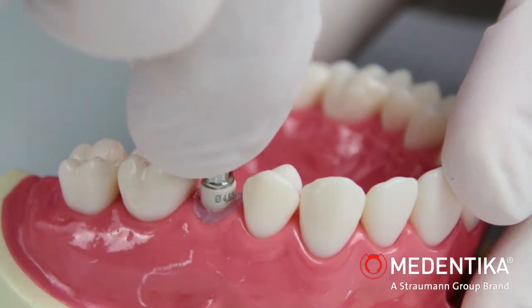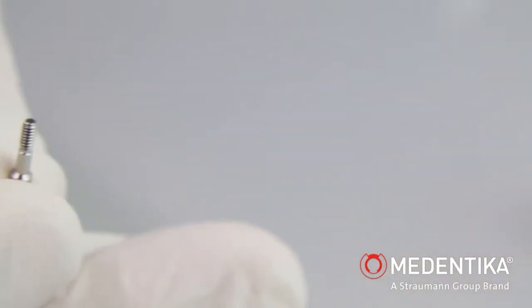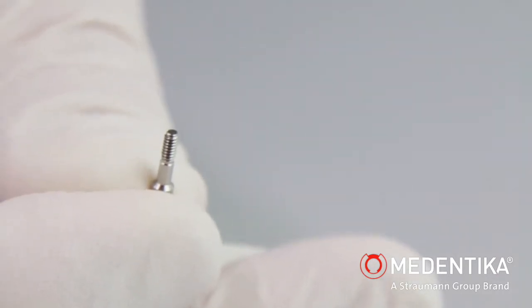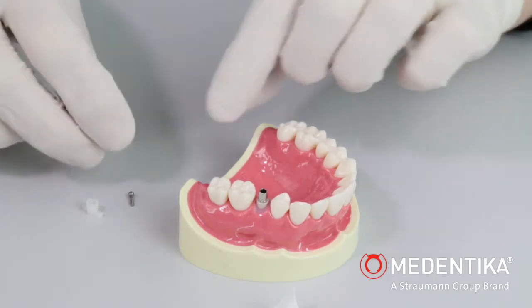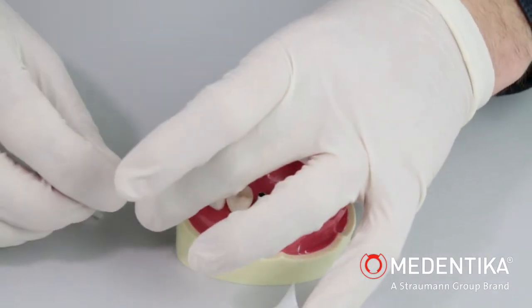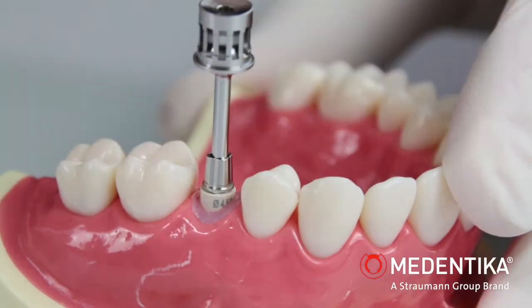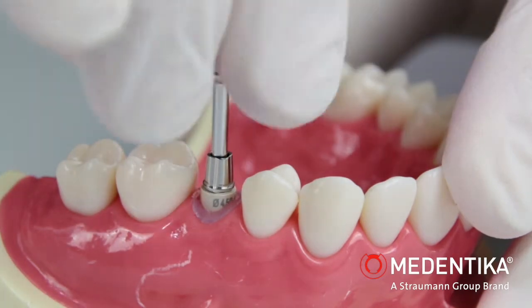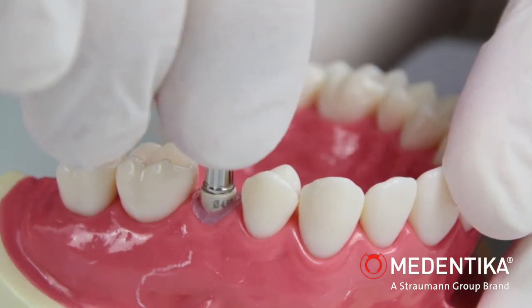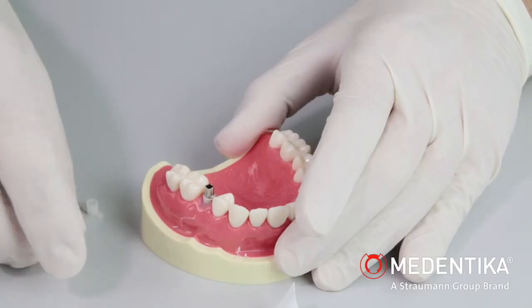The implant pickup and emergence profile are positioned on the implant. The retention screw is inserted in the implant pickup using the corresponding placement instrument. The positioning cap is placed.